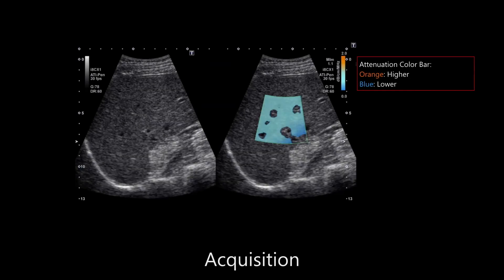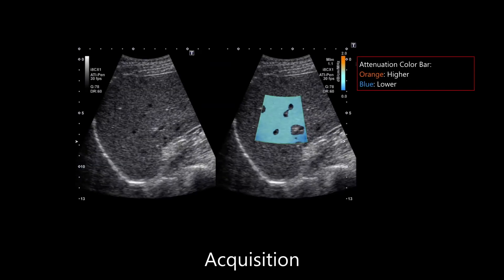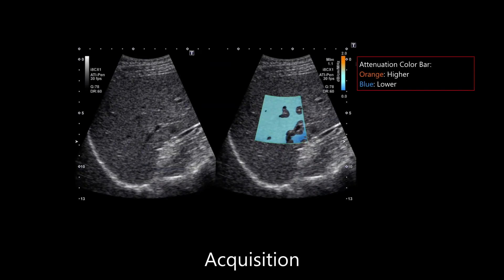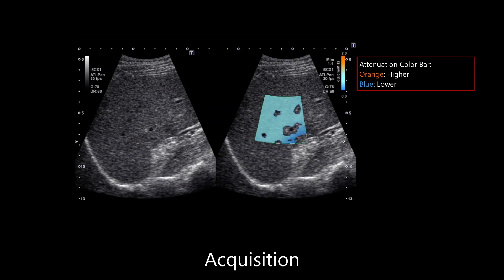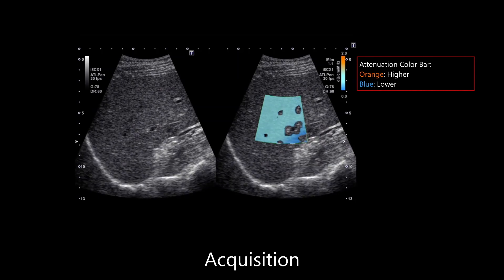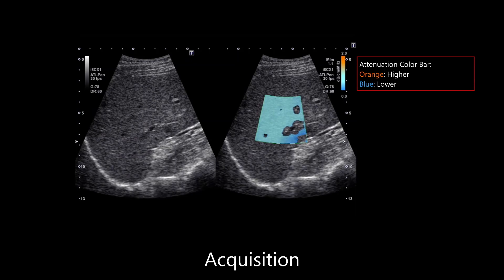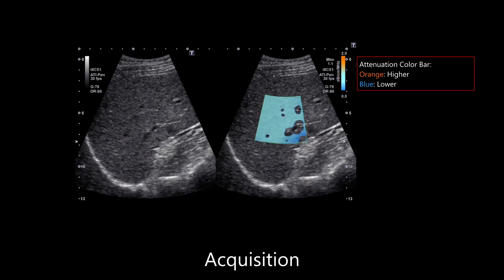This is easily accessed from the same acoustic window as used for shear wave elastography, allowing for seamless workflow, and can be launched via the touch screen. Here we see the imaging region of interest, or ROI, which enables an immediate visual assessment of liver attenuation. In this case, orange indicates regions with higher attenuation, and blue indicates lower attenuation regions.